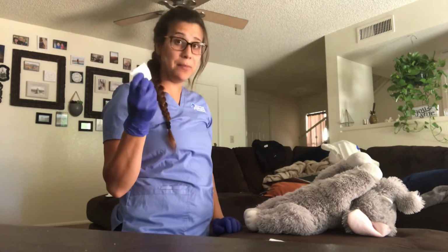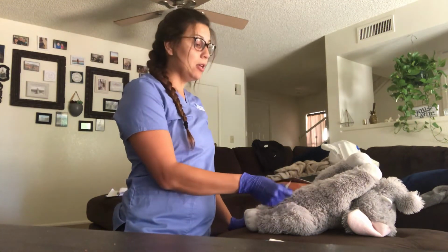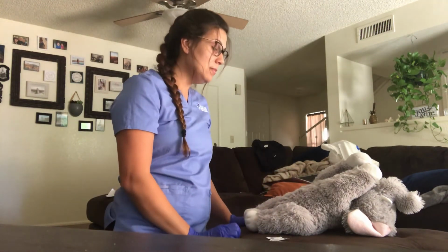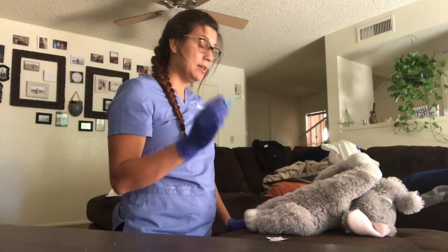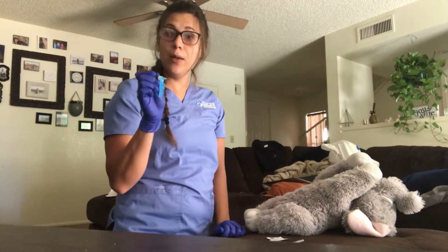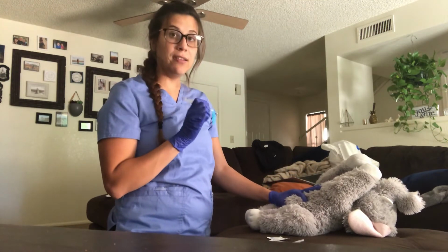You're going to clean the patient. You always want to start where the injection would go, and then you're doing a circular motion outwards, about 2 inches you're cleaning. And then you want to take your needle, pull the cap off, and hold it like it's a dart. Between your thumb and your forefinger, you would make a fold of the patient's skin.